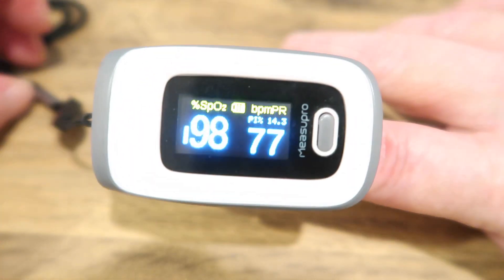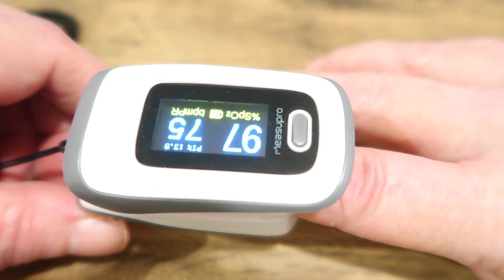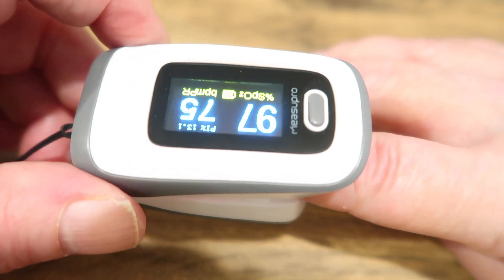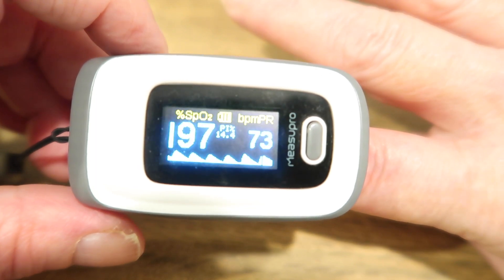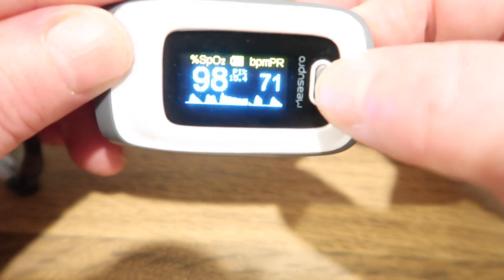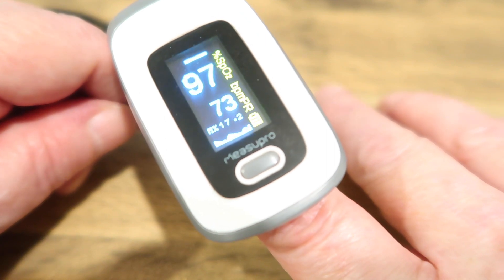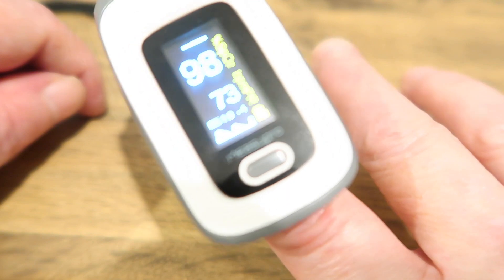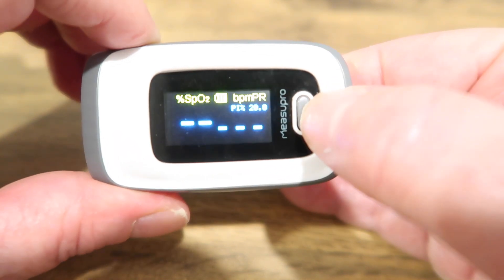You can have the display in different ways. Press this button and it changes so it's displayed to someone else reading it from the other end of the table, or you can have it showing a rhythm at the bottom so you can see if your rhythm is regular. You can also have it displayed lengthways so it's easier to see with your hands in front of you. If you get onto a funny screen, just keep hitting the button until you get back to where you want to be.